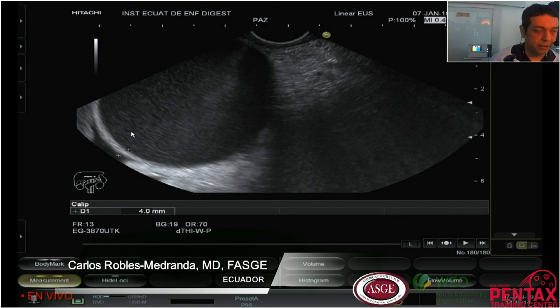possible due to ascites with carcinomatosis, and the radiologist sent her to us also because the amount of ascites made it not possible to do a percutaneous drainage. So we will show you today how we can perform a gallbladder drainage in this kind of patients. There is a publication from Itoi that I invite you to read about gallbladder drainage in this kind of patients.